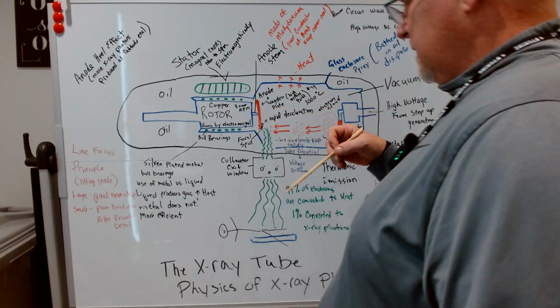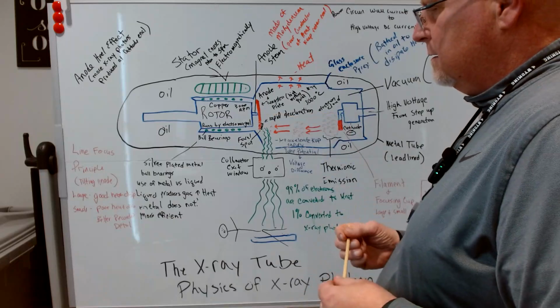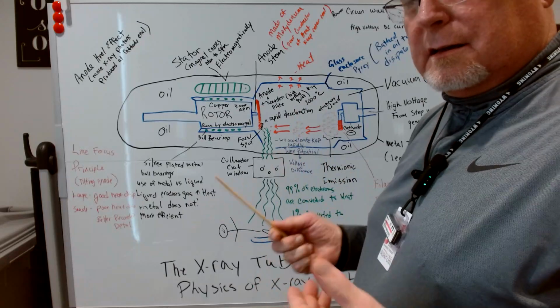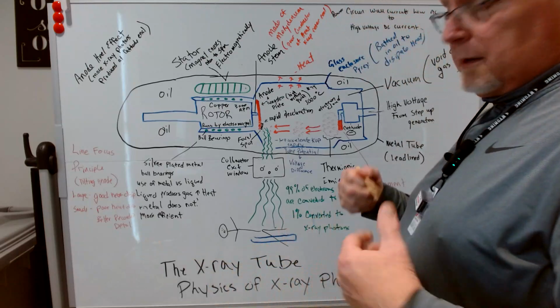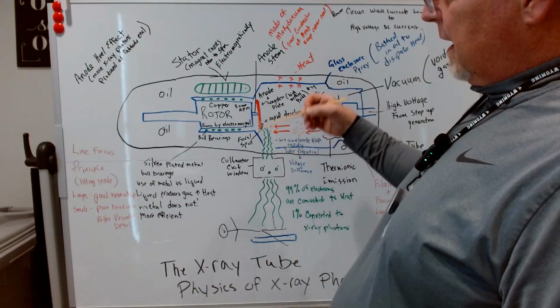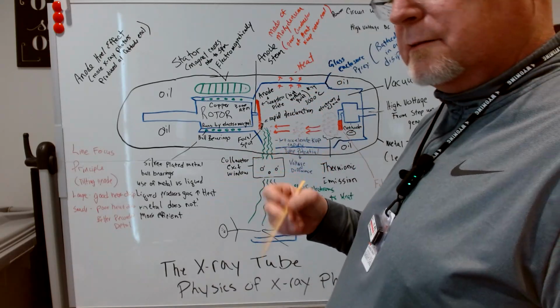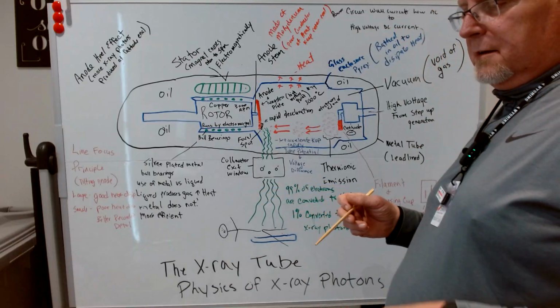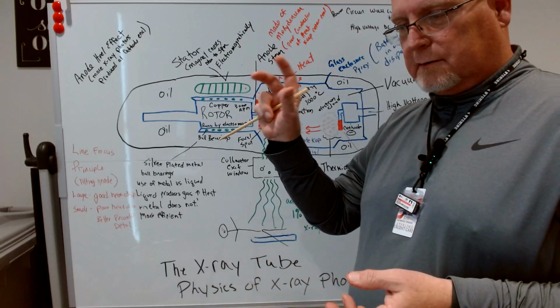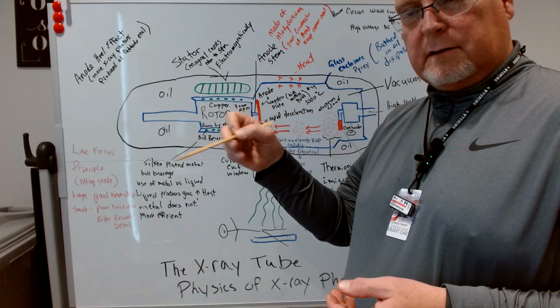And that's what we call the focal spot or the target of the anode. Now, you may think to yourself, geez, all that energy and all that heat hitting that one spot of the anode, that's a lot of pressure right there. And it is. We combat that though by rotating the anode. That anode is actually rotating 3,000 times a minute. So when you hit a rotor on your X-ray machine and you hear the machine start making a sound, that's actually that rotor turning the anode.